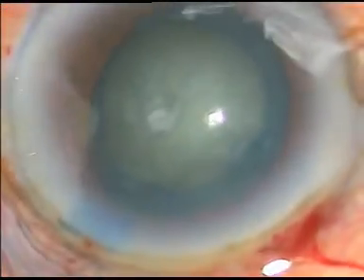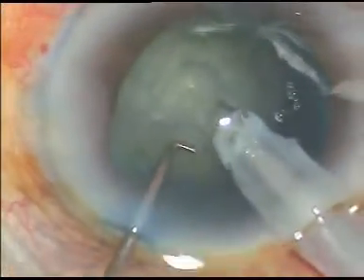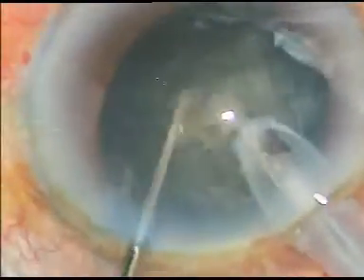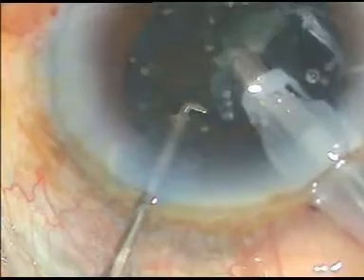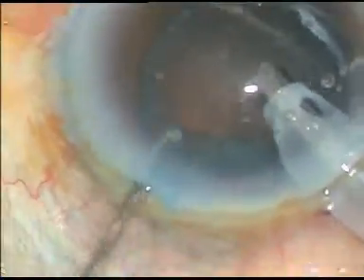Phacoemulsification is now started using direct chop technique. The nucleus is divided into several fragments by direct chop — there are different ways of making fragments. The fragments are then emulsified, and this is the epinucleus.